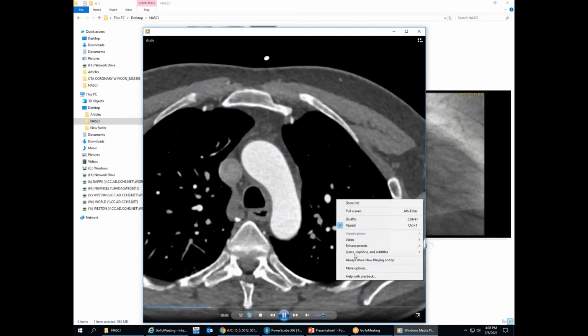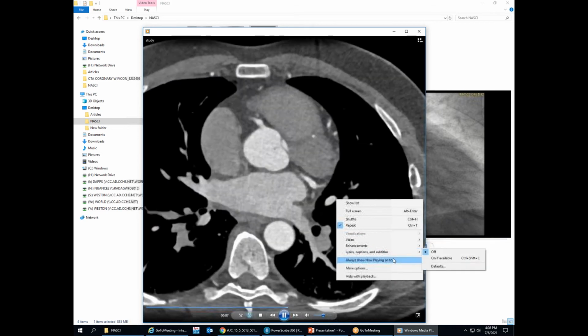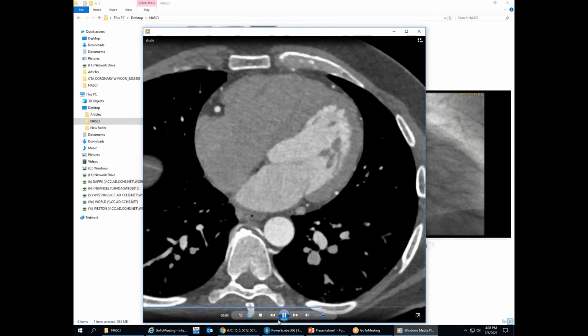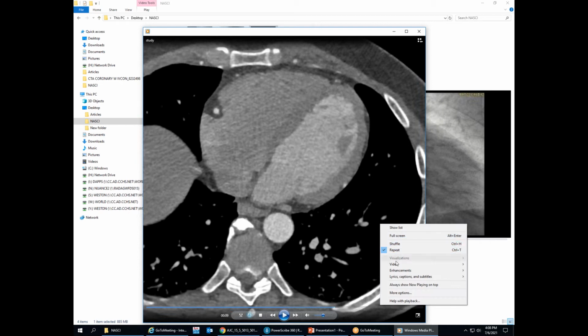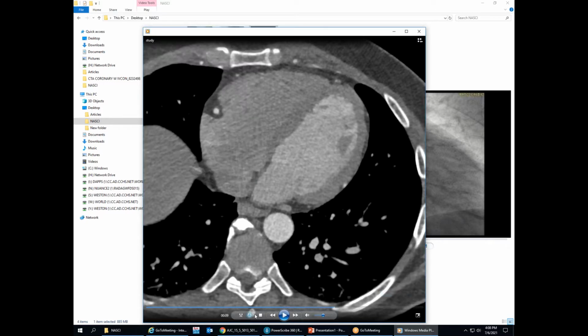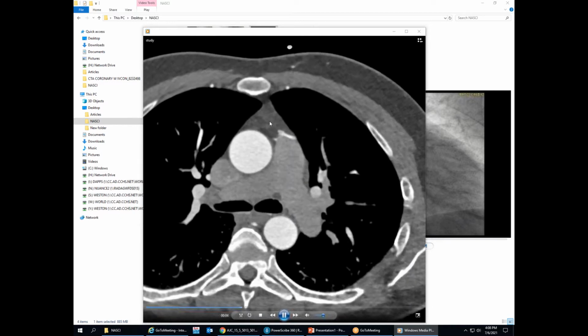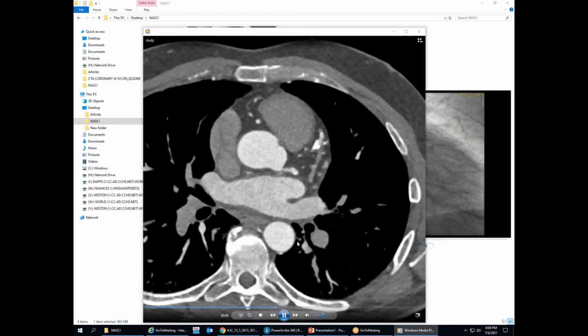So this is a quick case. It's a 55-year-old marathon runner, coach, healthy. For some reason, at an outside institution, he ended up getting an exercise stress exam that showed an equivocal EKG. That led to a nuclear stress test that showed an apical defect, and that led to a coronary angiogram that showed no obstructive disease, but some interesting findings.